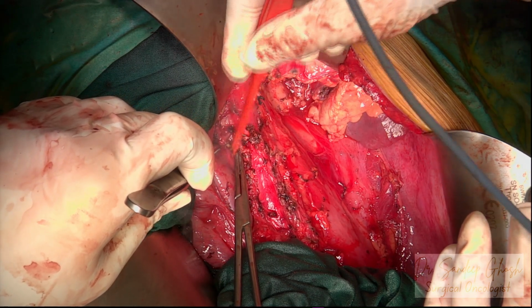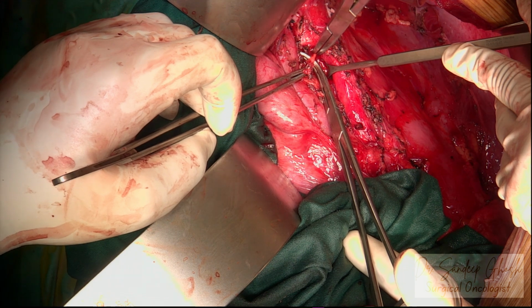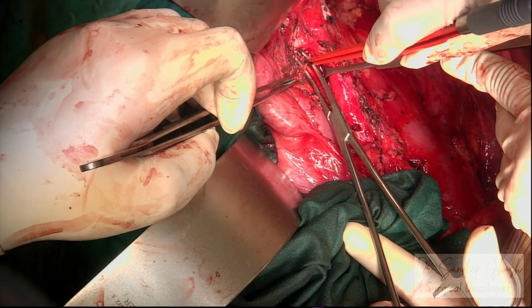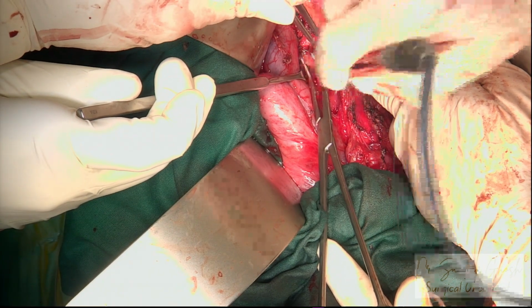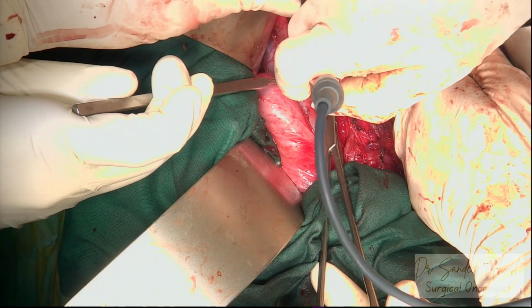We are starting at the superior aspect, just underneath the renal vessels. We always clip before we remove the lymph node. This helps prevent any chyle leak post-operatively or chylous ascites.